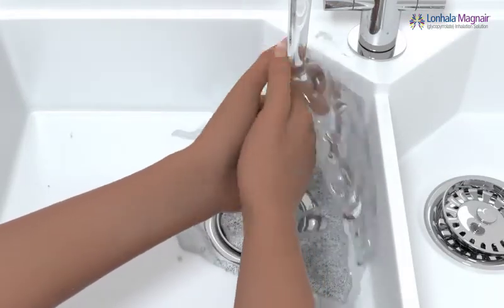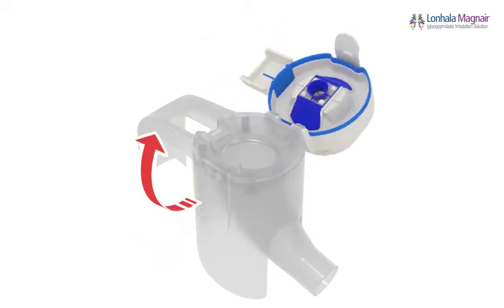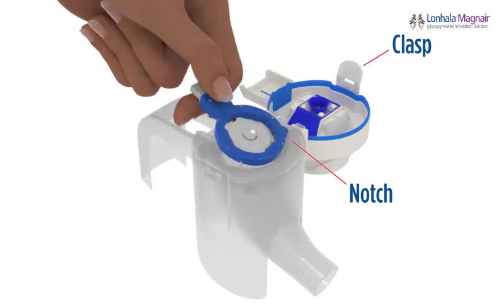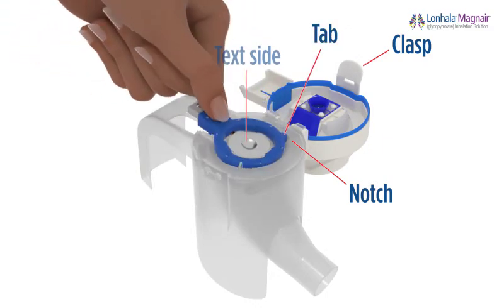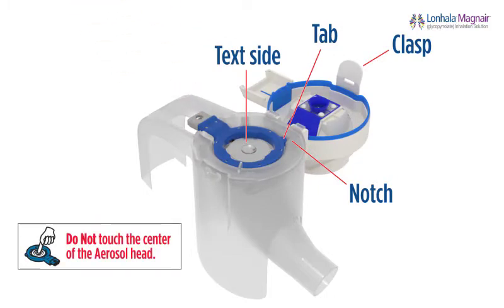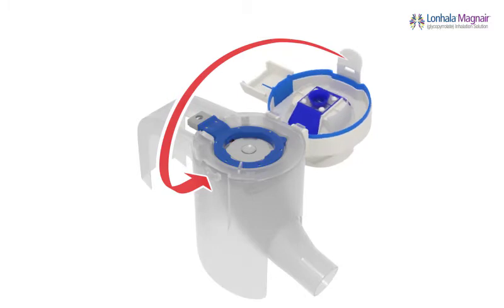Make sure your hands are clean before assembling your Magnair. Open the top of the handset body by lifting the clasp and flipping it open. Insert the aerosol head into the handset body. Hold the aerosol head like a small frying pan so the silver text side is facing up and the brown ring is facing down. Do not touch the center of the aerosol head. Align the small tab on the aerosol head with the matching notch in the handset body. Close the handset body, making sure the aerosol head is properly inserted and the tab is aligned with the notch and level with the handset body.